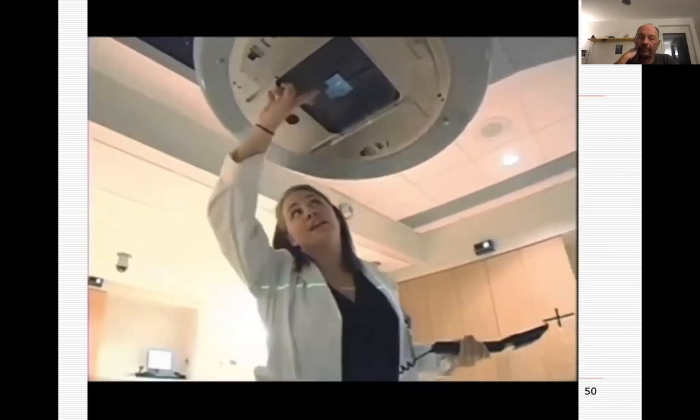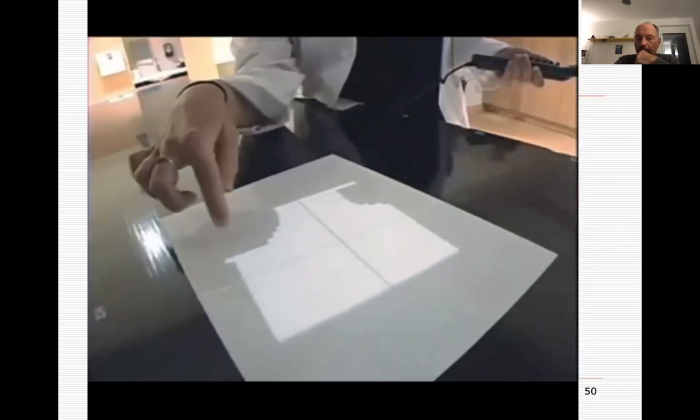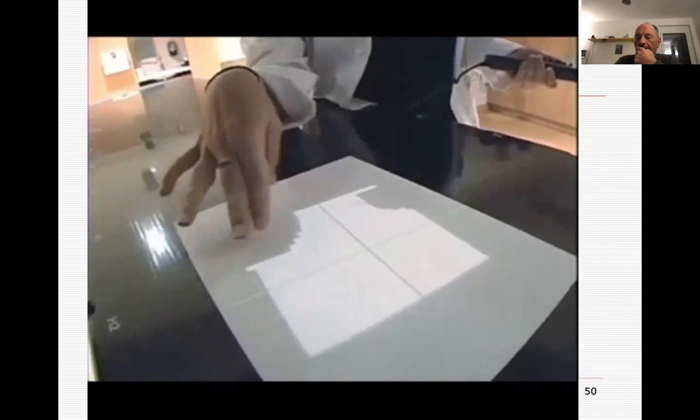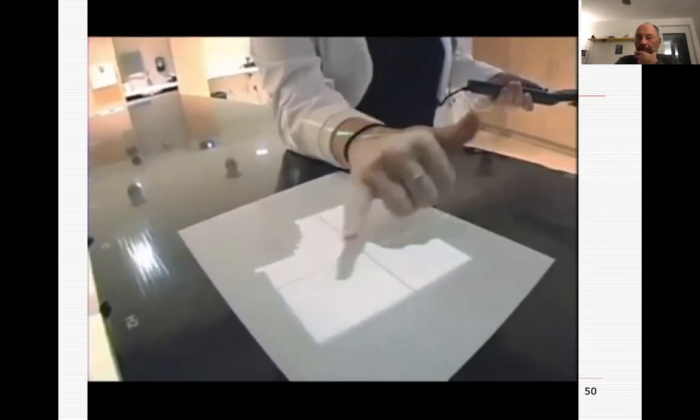And inside of the head here, there's hundreds of little lead leaves. You can see that move in and out to create any shape necessary for treatment. No 2 tumors are exactly alike, so these leaves enable us to be very custom for each patient. So in the light field here is the area that we're treating. In the gray spot here, we could save healthy tissue or protect critical structures from getting too much radiation while still delivering 100% of the dose to the areas within the light field here.